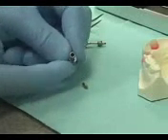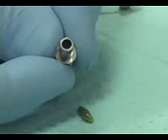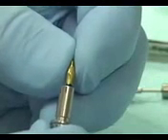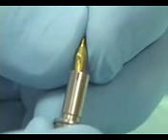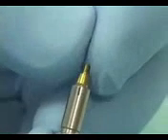So now for placing the abutment in the implant, we take one of the drivers that has a hollow opening in the top of it, and where the small black line is, it's difficult to see, but on the inside of this hollowed out driver is a small little positive bump. And so when we place the solid abutment in the driver, we line the groove up with that black line, and then those will friction fit very nicely.